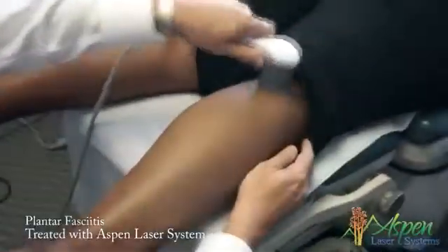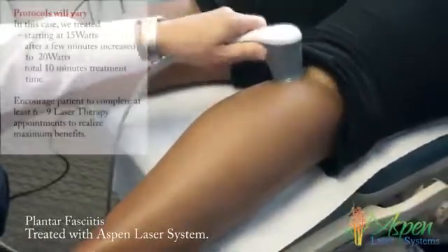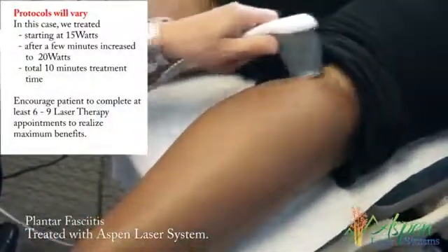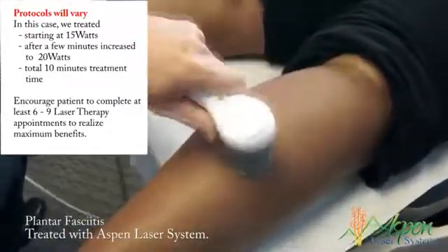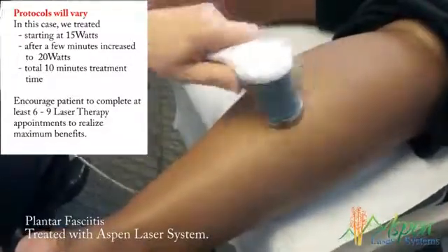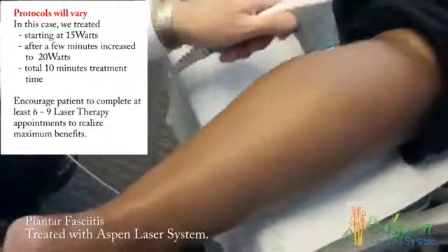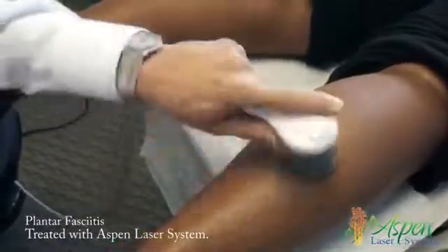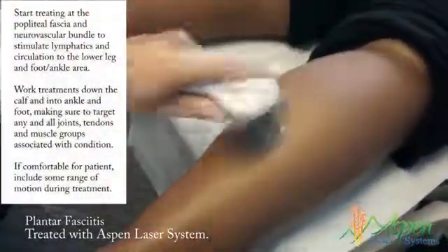As it gets too warm, you let me know. It should feel good — we're stimulating the lymphatics and the neurovascular bundle up in here. We'll do this for almost a minute. You can go the long ways or you can go circular. Halfway through this I'm gonna have you move your ankle back and forth. This is called bio-stimulation — we're stimulating the ATP production through the mitochondria.